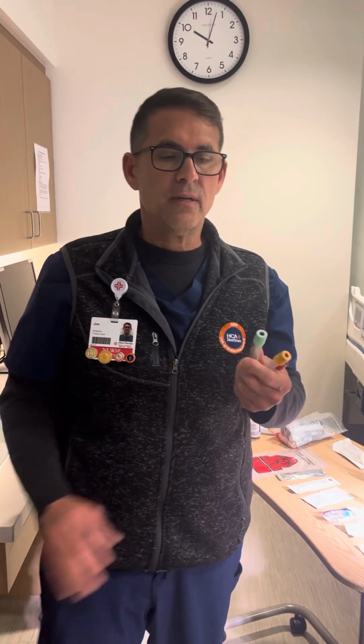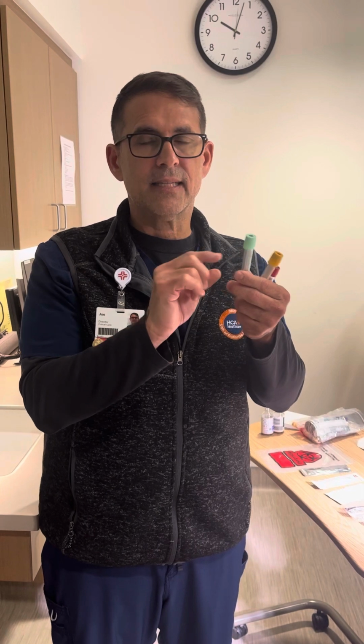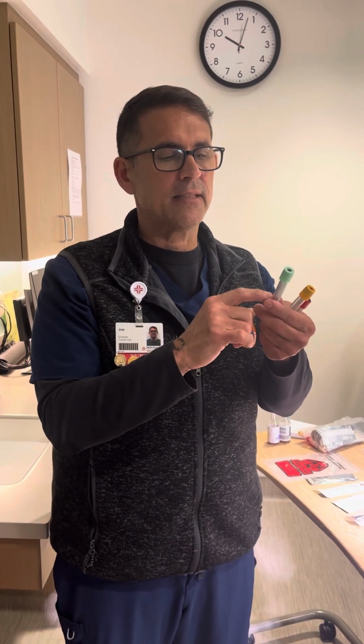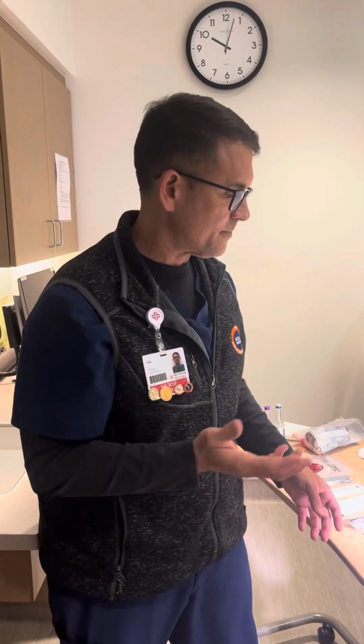When you spin down these tops and you see the serum that's left over, it should be a clear yellow. When it looks pink, they know there's some hemolysis in there. Depending on the grade of pink, they say it has grade 1, grade 2 hemolysis. If it's more than just a little hemolysis, they'll throw the sample away because it's no good. How do you avoid hemolysis? Remember, it's the breakdown of cells. Hemolysis is completely avoidable, and it's only caused by the drawing process. So if you are constantly having labs that are hemolyzed, there's something you're doing when you draw your blood that you need to change.